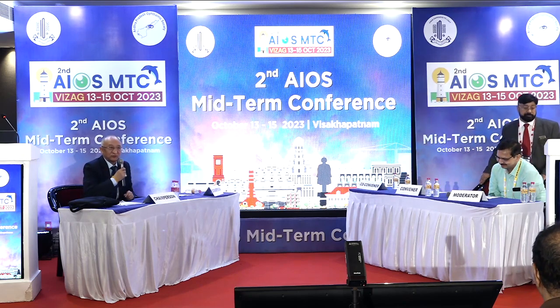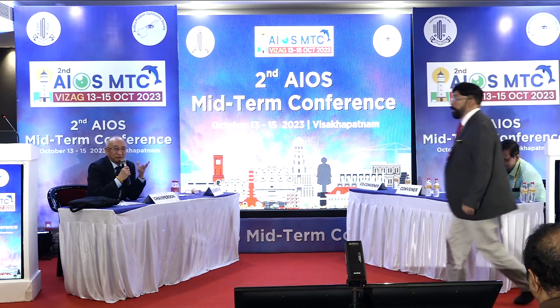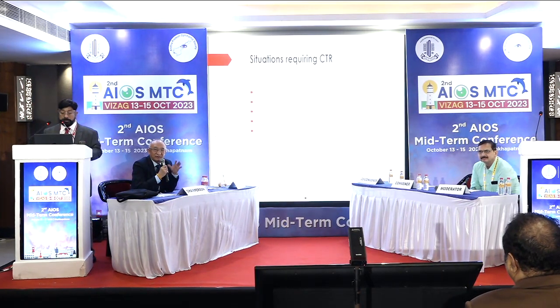The sir is going to talk about demystifying CTRs. As you saw in this particular case, how to put a CTR, how to select CTRs, which are those cases, sizing, fixation, various things are there with CTR, and it is one device which should be there in your operating table most of the time, because subluxation can occur any time during your procedure, even in normal cases sometimes. The CTR, if there, it's always handy.